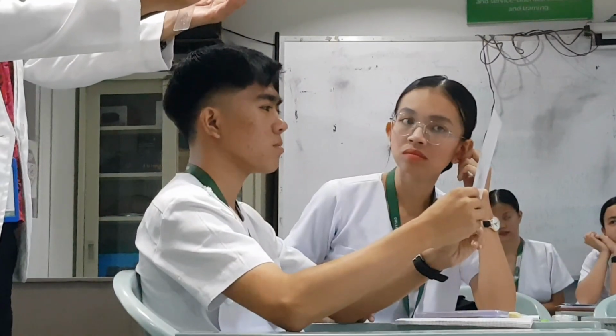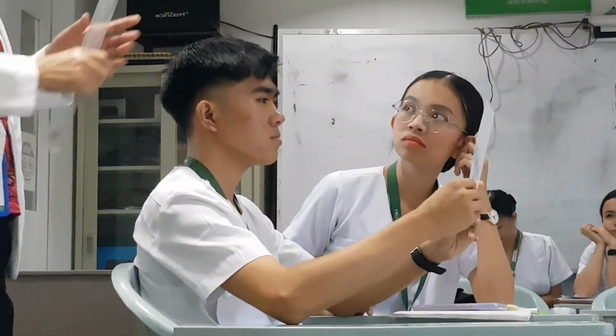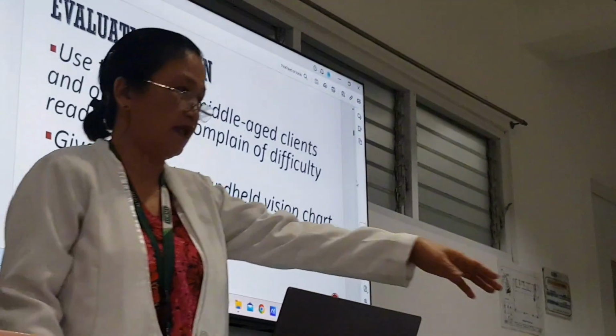Yun ang inaano ng ating mga ophthalmologists. That's why they are going to give you that how far yung nababasa mo, yung gaano kaigit. So that the ophthalmologist will measure now your eyes, near acuity, your near vision acuity. Okay, that is your Jaeger reading. Okay?